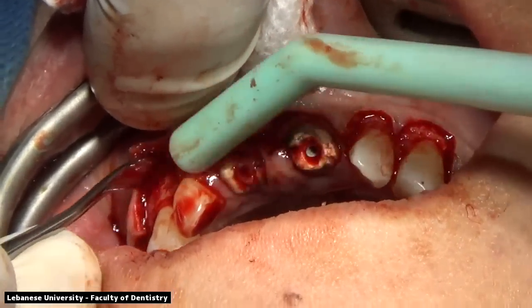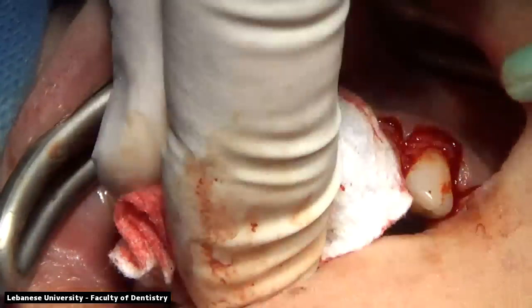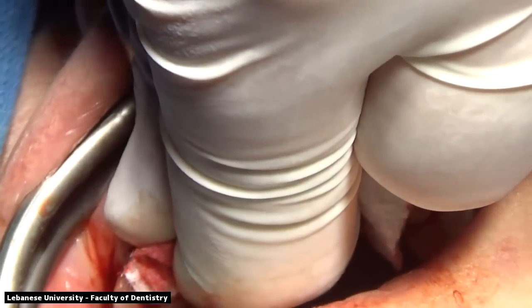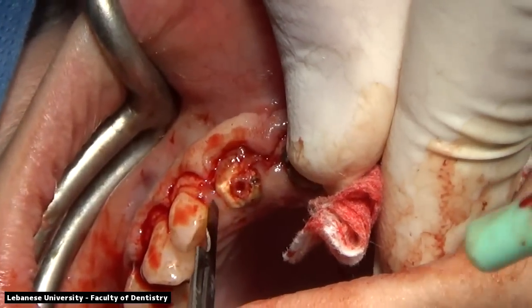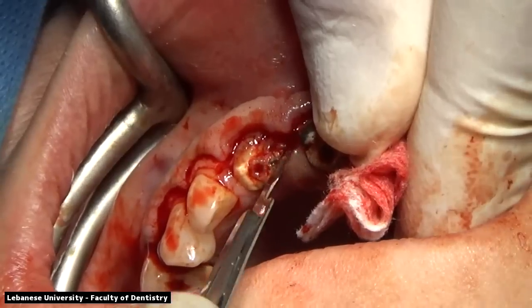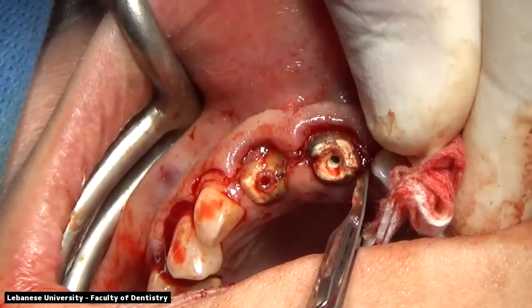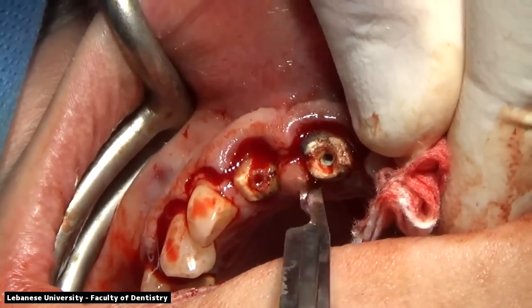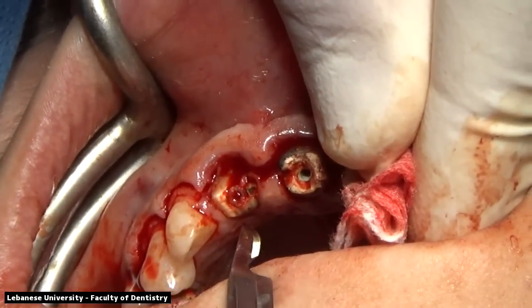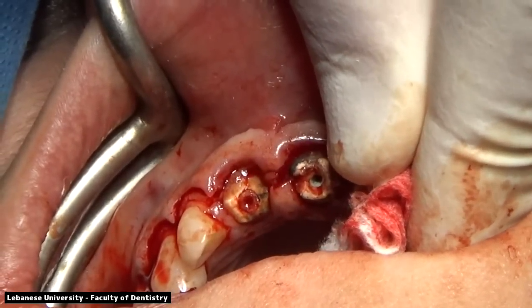We can see some fibrous tissue and some granulation tissue around the right central incisor, which has been the cause of the problem and the chief complaint of the patient, and this is where the fracture happened when there were ceramic crowns on those endodontically treated teeth. We're extending our flap now to the palatal aspect, and we're also doing a full mucoperiosteal flap, including the papillas on the palatal aspect. The full mucoperiosteal flap on the palate will also extend from the right canine to the left canine.